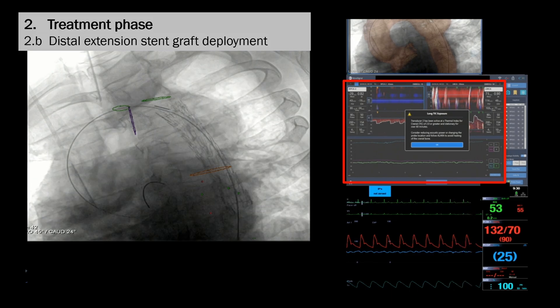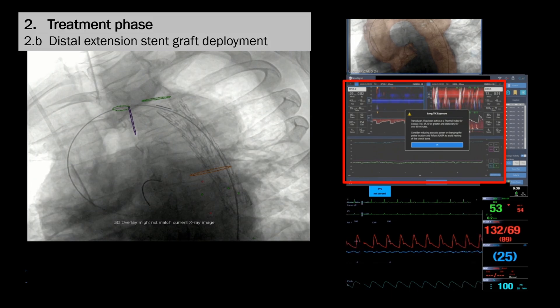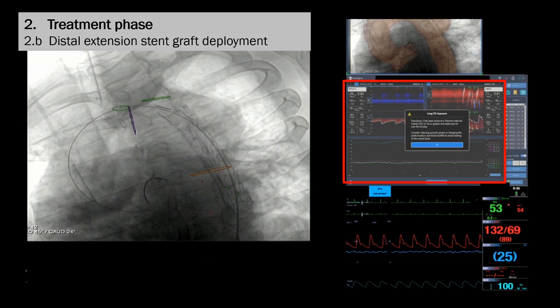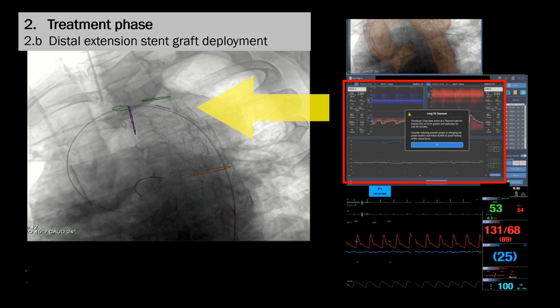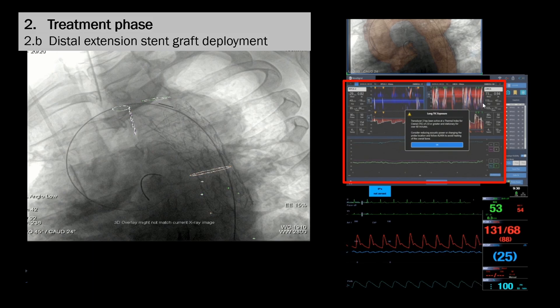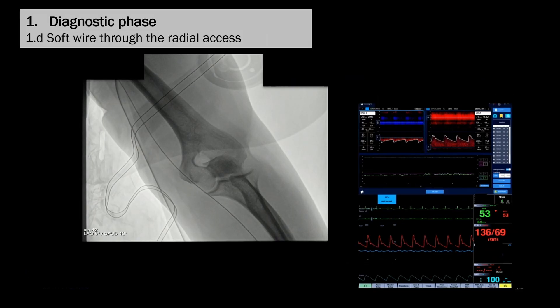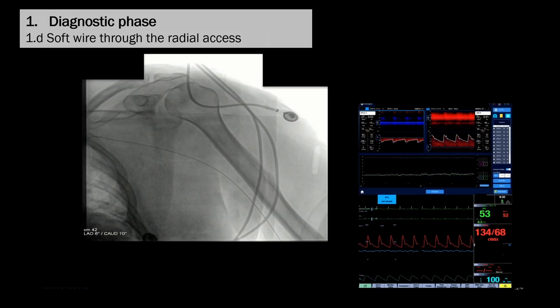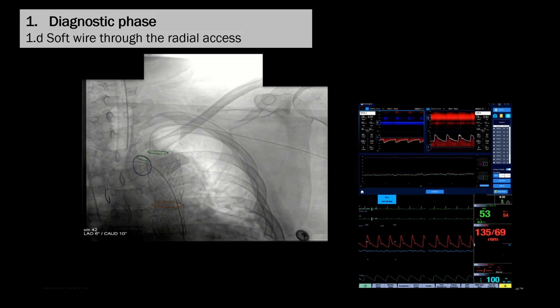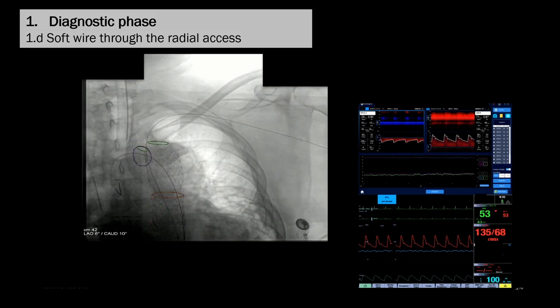The TCD machine is meanwhile reminding us to adhere to the ALARA principles, which emphasize minimizing ultrasound exposure to as low as reasonably achievable levels. The second wave of hits arrives during the full deployment of the stent graft, and here we can see hits bilaterally. A soft glide wire was directed from the left radial access through the left subclavian artery into the distal stent graft, and this phase caused no hits on the TCD screen.